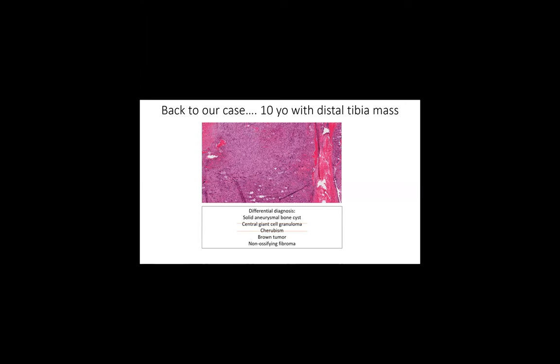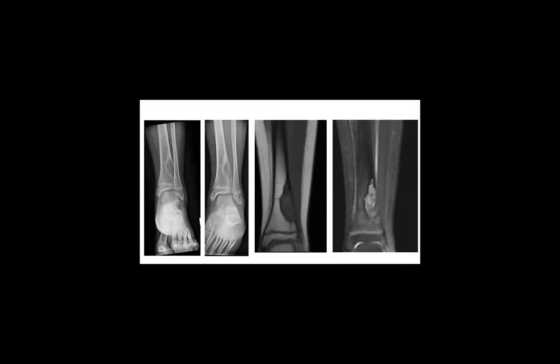And in these situations, I bring the radiology and discuss it with Dr. Illeslan. In this case, I also saw areas where there were foamy histiocytes, macrophages, and a very storiform pattern. So that was leading me to favor NOF. But again, I always share these cases with Dr. Illeslan. I don't know if in this case there would be anything that would lead you to favor NOF over solid ABC.